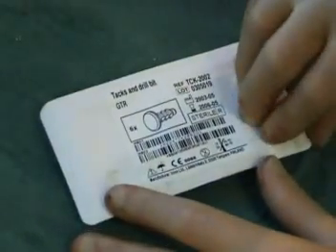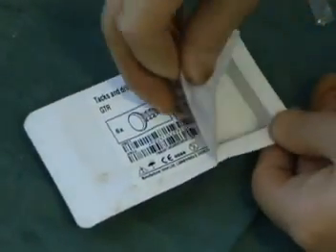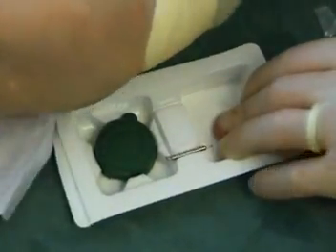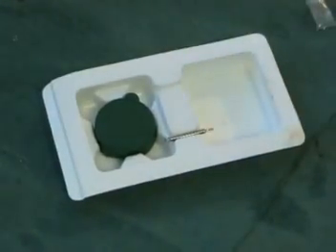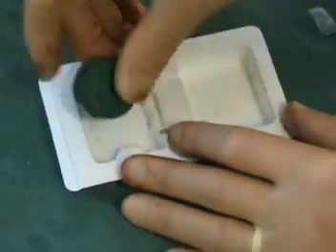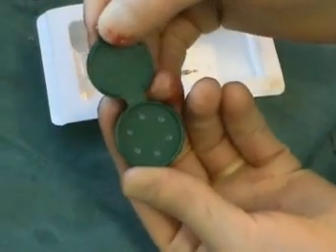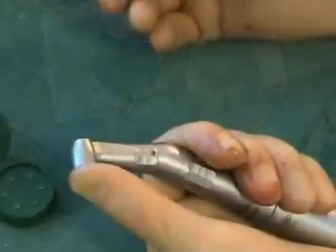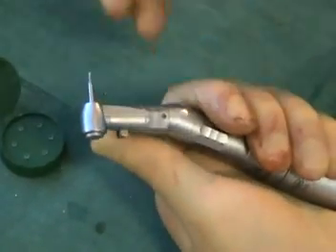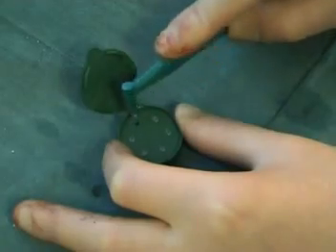The next stage is to unwrap the tack fixation kit and carefully open the plastic dispenser without dislodging the tacks. The sterile bur provided should be loaded into the contra-angled handpiece. A tack is then fastened to the tack applicator.